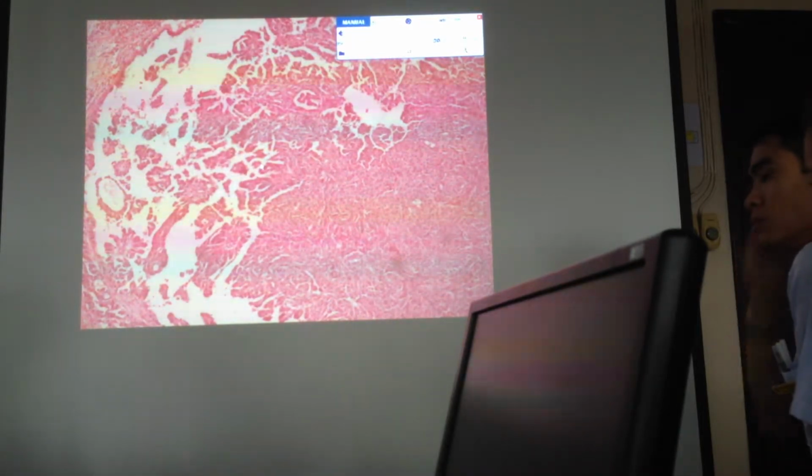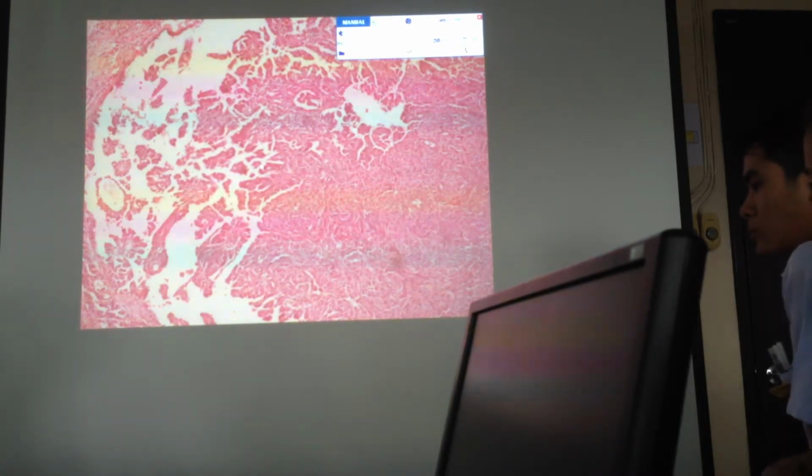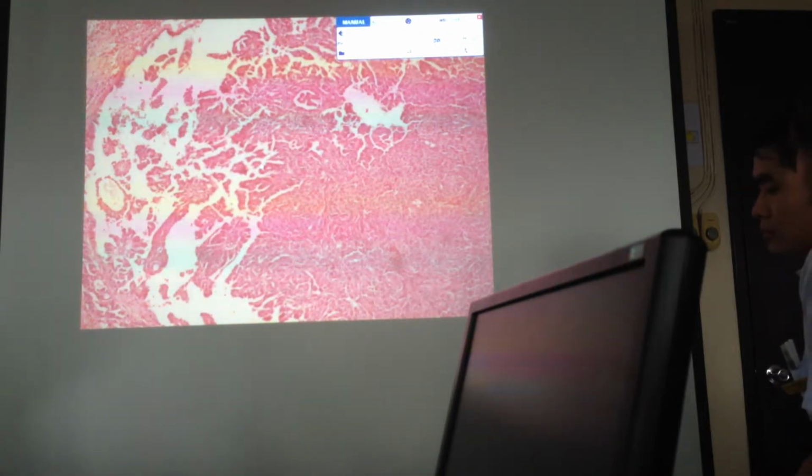For serous tumors and mucinous tumors, again, if you have read the book, they would be labeled as benign, borderline, or malignant. So when you say benign, you have serous tumors that are lined by a single layer, then they look benign.